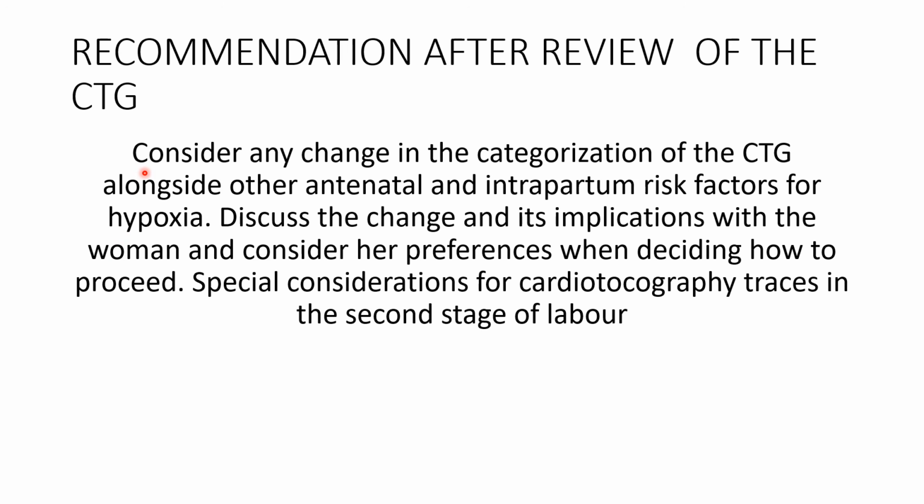So how do you report and how do you recommend after review of the CTG? Consider any change in the categorization of the CTG alongside other antenatal and intrapartum risk factors for hypoxia. For example, if the fetus is intrauterine growth retarded, if the mother is anemic, has a cardiac problem, or if she is bleeding, discuss the change and its implications with the woman and consider her preferences when deciding how to proceed. Special considerations for cardiotocographic traces are present in the second stage of labor.